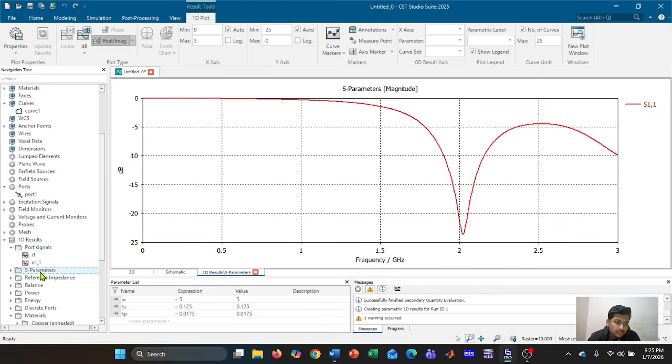Here red ones are the input signals and blue ones are the reflected signals. If you look at the S parameters, at 2.1 or 2.2 gigahertz the frequency has the minus dB S parameter, which is actually the reflection coefficient. You can see when the curve goes down, the antenna works better. The deepest dip is around 2.2 gigahertz. At this frequency, most of the power goes into the antenna, which is ideal for medical implants.